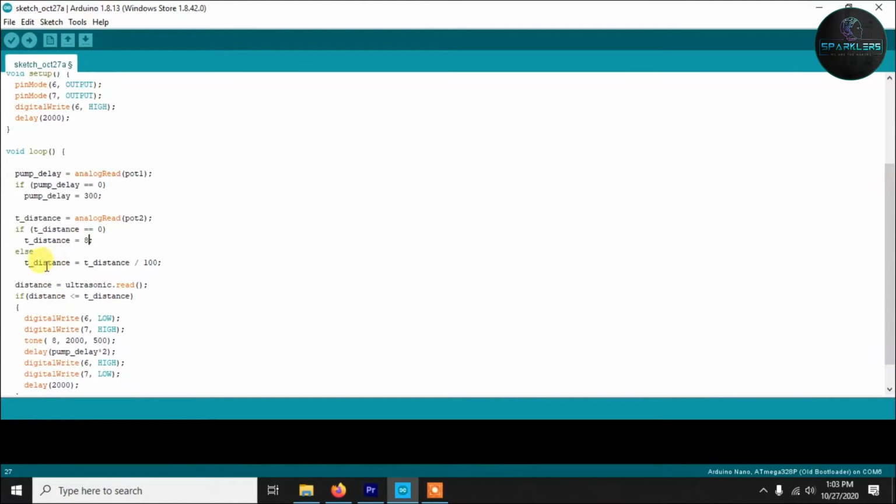Except that, we will set the t distance as t distance divided by 100. Now 100 means that it will divide by 100. So the t distance is initially from 0 to 1023. After dividing it by 100, we will get 0 to around 10. So the range of this t distance will be 0 to 10. By changing this calculation, you can change the range. That's up to you. These values are suitable for my purpose. For your purpose, you may change these things.